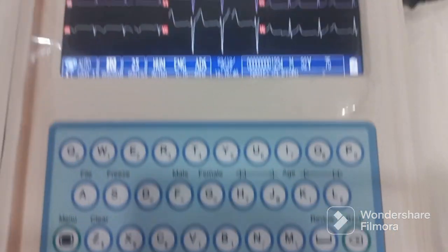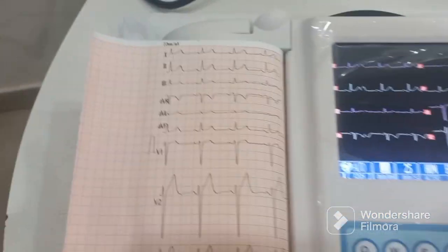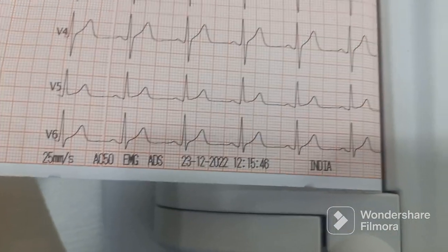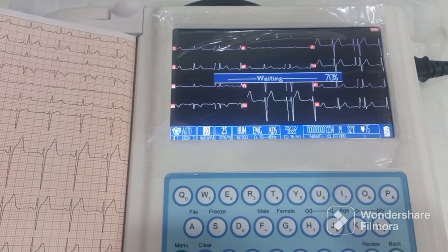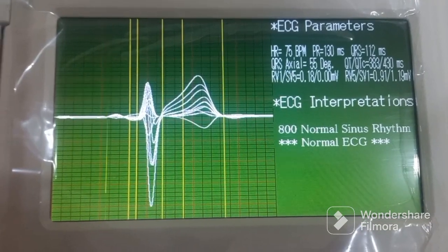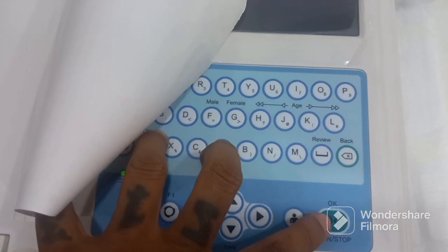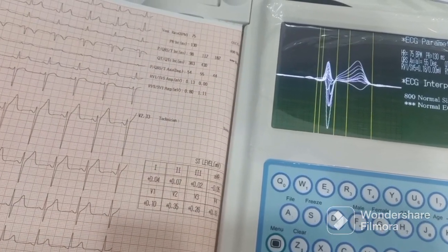In auto mode, to take a print you just press the print button. Once you press it, the print will start and you'll get all 12 leads on screen along with all the information and the interpretations. Once you get this, press the run button again and it will print on the paper as well.